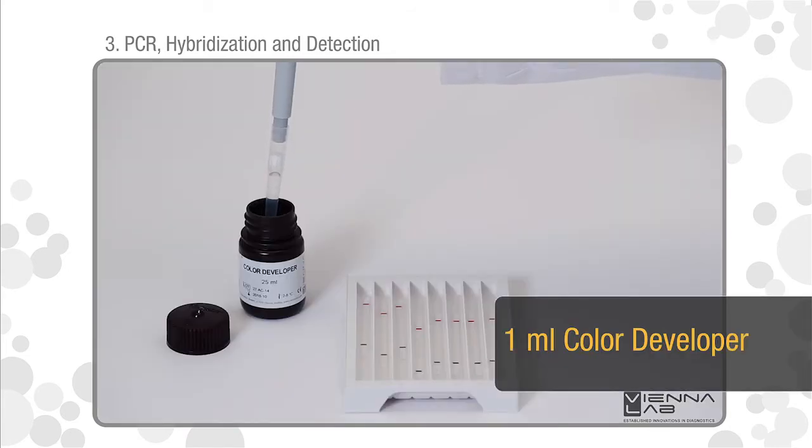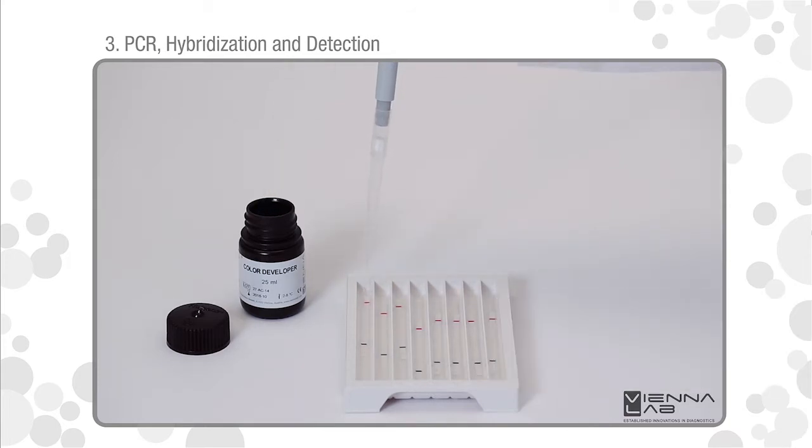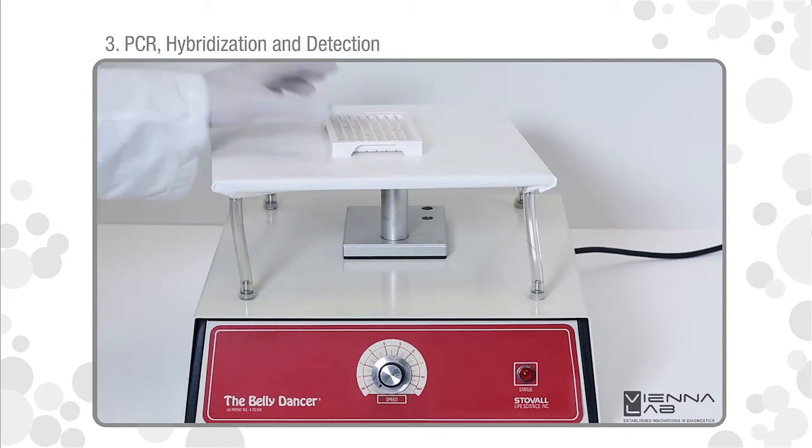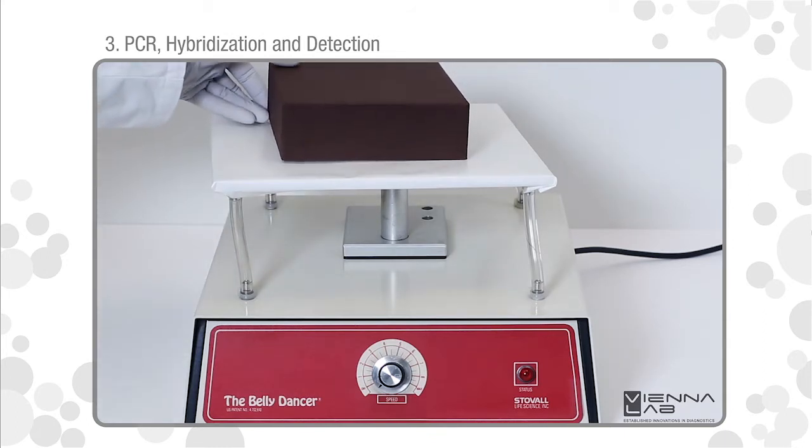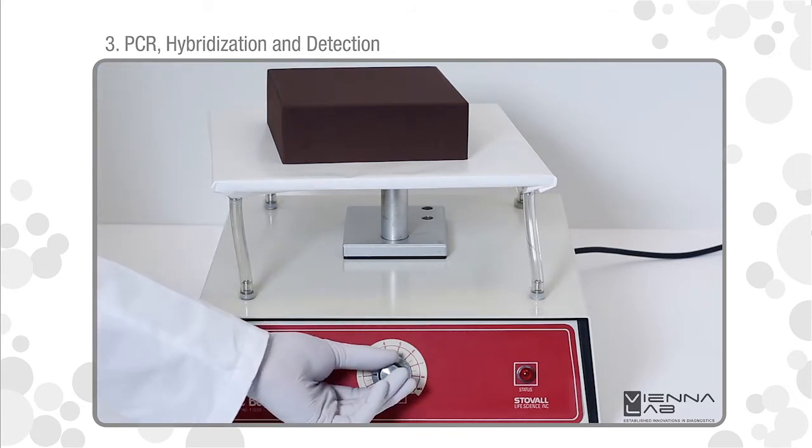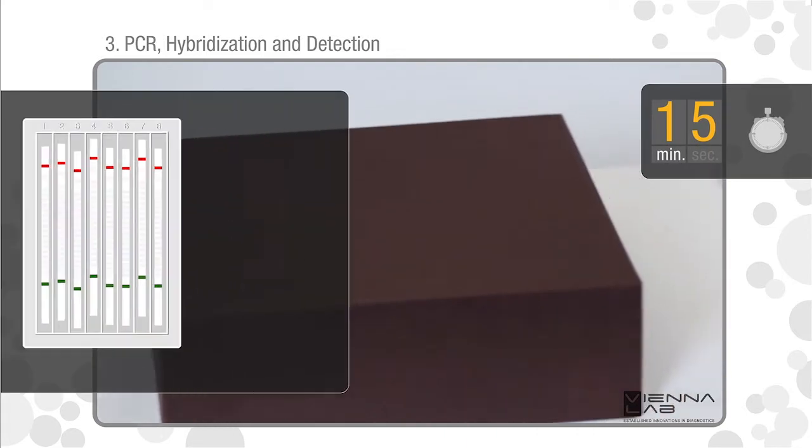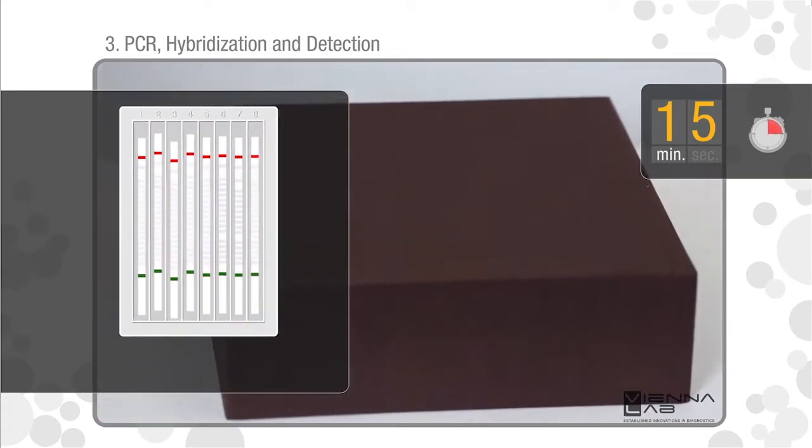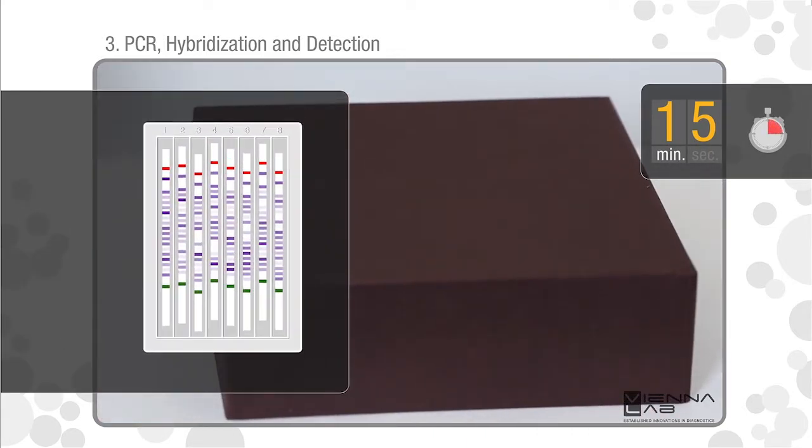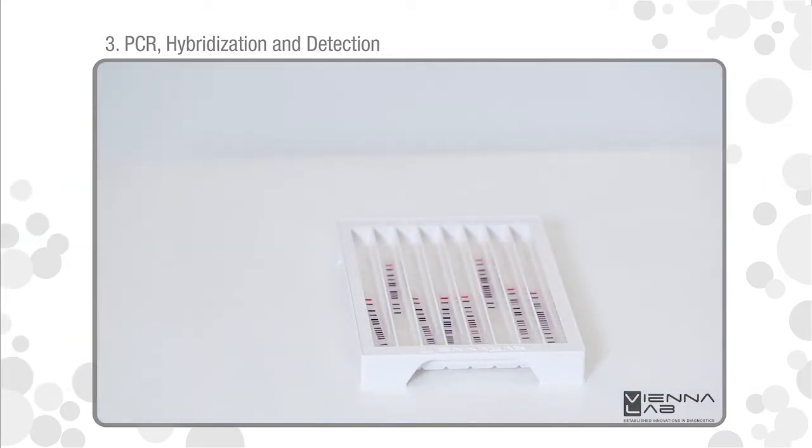Add one milliliter color developer. Incubate for 15 minutes at room temperature in the dark on a rocker or orbital shaker. A purple staining will appear upon positive reaction.